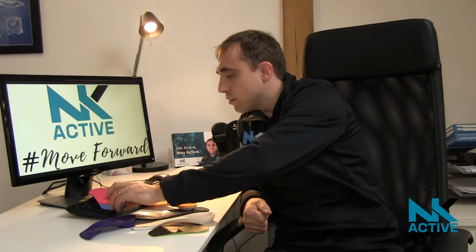So what we'll tend to try and do is, if we can manage someone in 3 to 6 months, we'll give them a set of off-the-shelf foot orthoses if it's the right product for them, and we use that as a tool to help offload a structure, so then you can do your exercises, get stronger, and once you're stronger you may not need the foot orthosis again. And there are still times where you need a foot orthosis short term, but what you need the orthosis to do for you is too much for what an off-the-shelf product can do. We have to get something a little more bespoke.